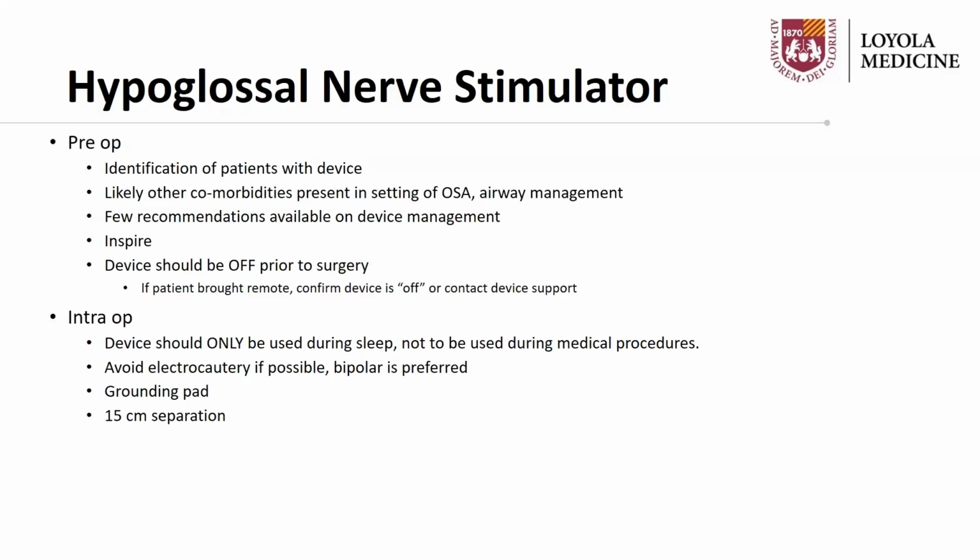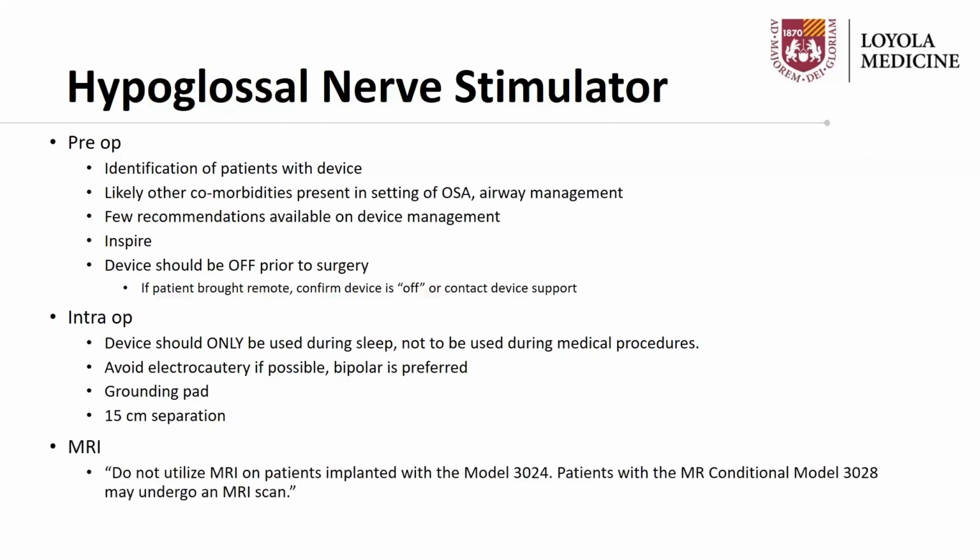of the surgical procedure. If performing MRI, recommendations were interesting in that prior models are not MRI safe, but newer ones are. So for these reasons, it's important to really contact the manufacturer to find out exactly what device the patient has prior to going to the scan.